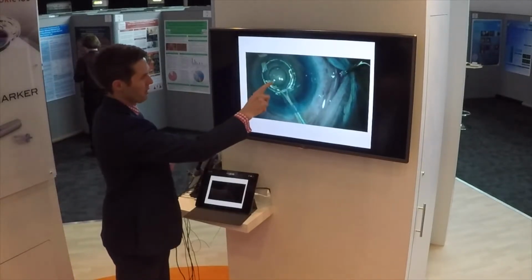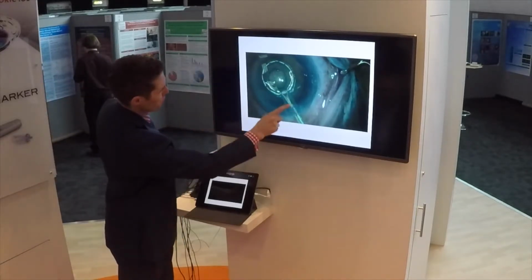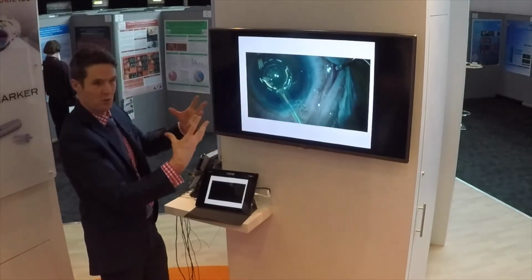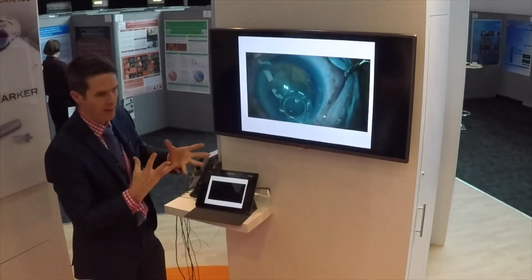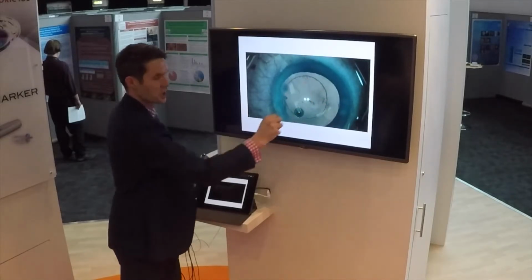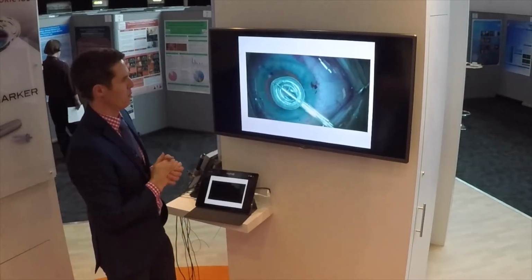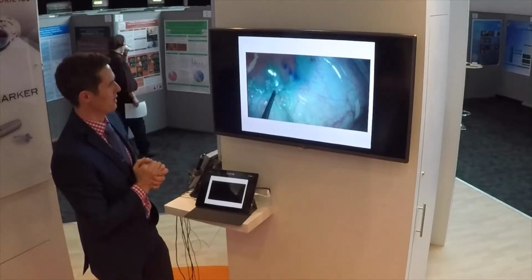What I would do now is center it on the Purkinje images, but at the time I was just glad to do it. You can see these bubbles going, which means it's attaching to the anterior capsule. Did you see that pulse there? I've slowed that down so you can see the pulse going through the nitinol. It doesn't normally appear like that. And then you can see a very nice round edge to the capsule. As I said, I've done it a little bit off center there. This second case is quite interesting.